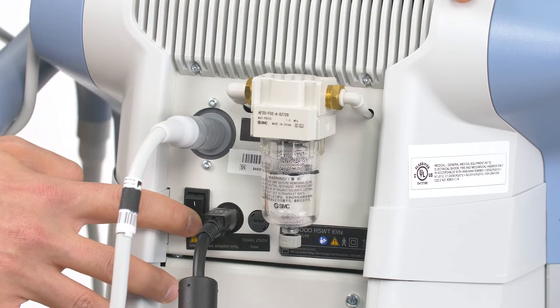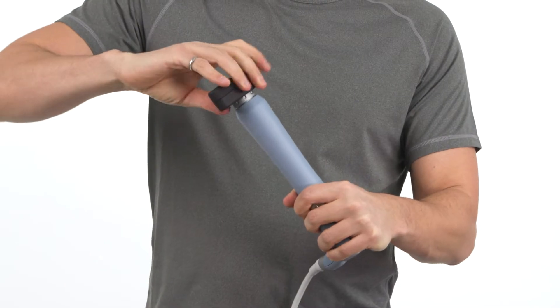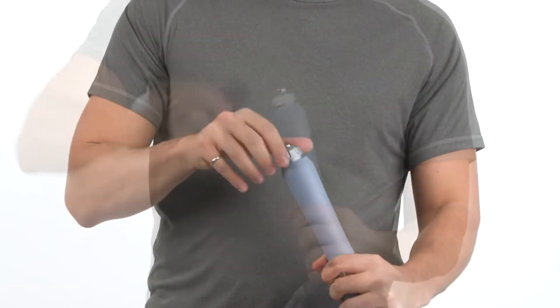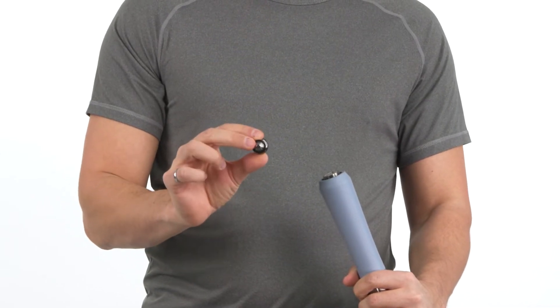Power off your shockwave unit and disconnect the applicator. Use the universal wrench found in the applicator box to loosen the transmitter holder. Remove the transmitter holder and the transmitter.